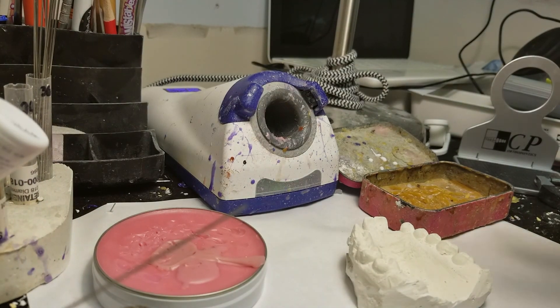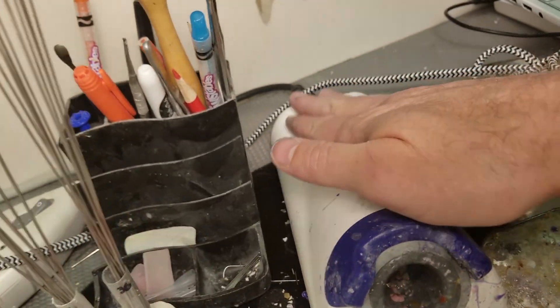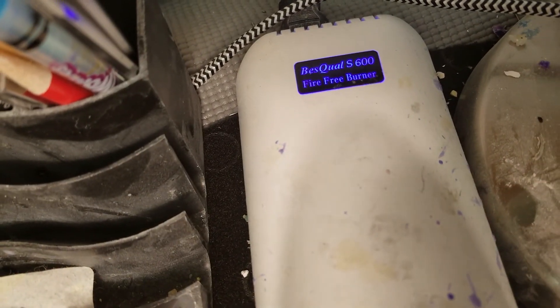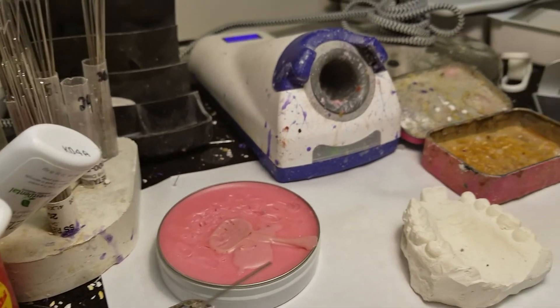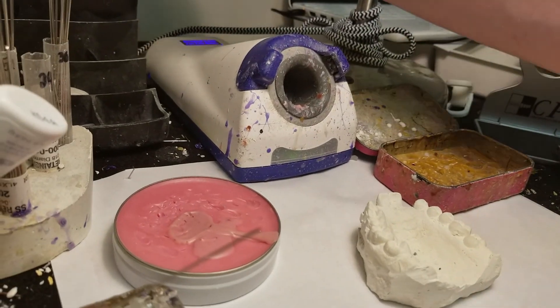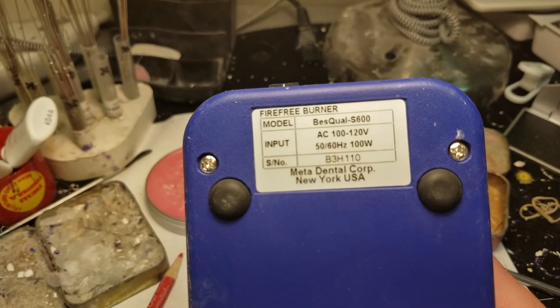I did a quick setup here — put a piece of paper down because my table is dirty. This is the end of the day for me. This is the BesQual S600 fire-free burner. What it is is a fireless instrument warmer.